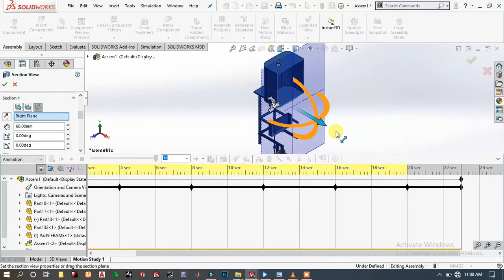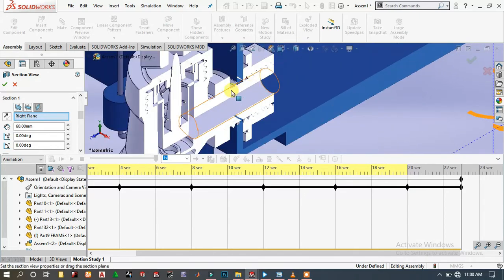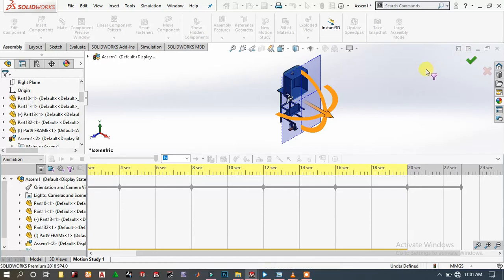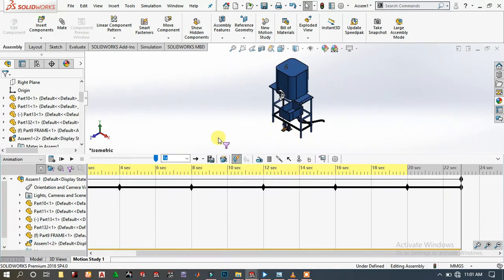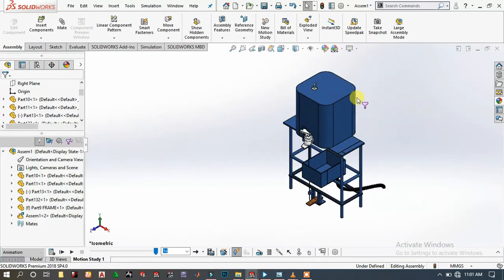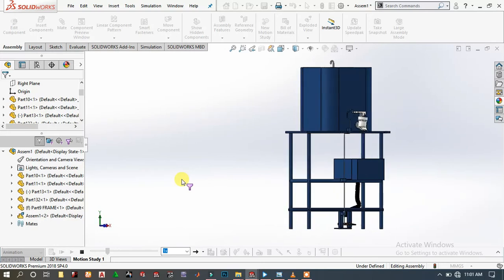Here is the section. So right click, disable auto key creation. So when we change the position of this handle, we don't get an automatic key that we don't want.